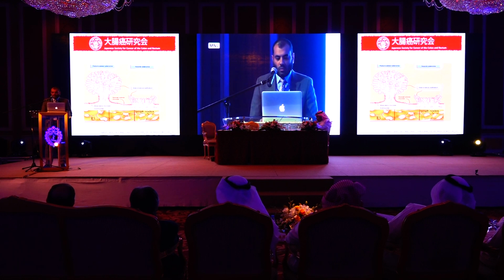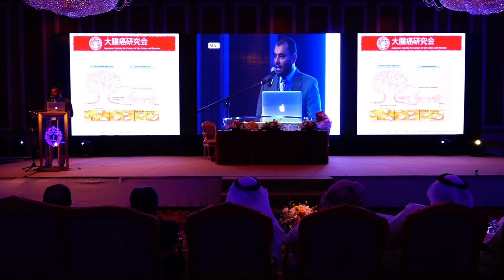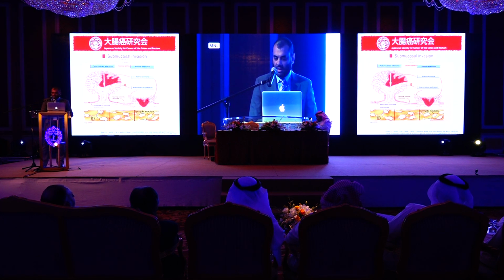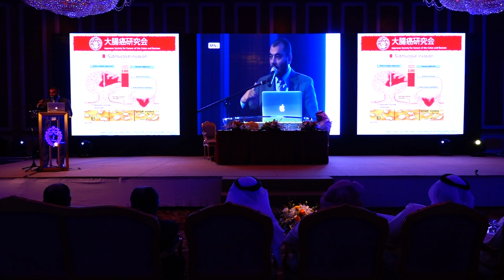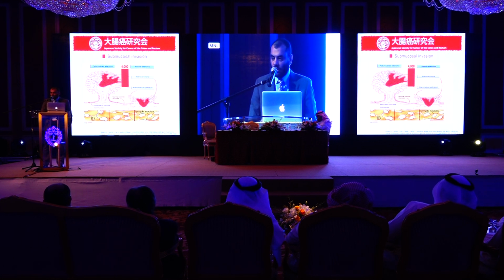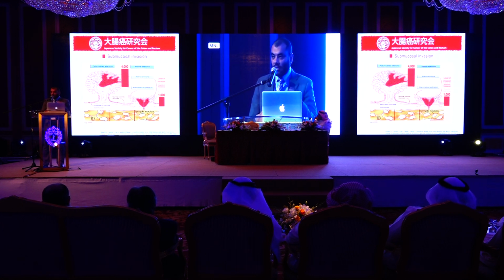We'll explain more. What is the meaning of that? This is just an adenomatous polyp here. It doesn't have any high-grade dysplasia or cancerous tissue. If there is cancerous tissue in the head of this pedunculated lesion, and the depth of invasion of this cancerous tissue is more than 3,000 microns, we will expect lymph node metastasis. If less than 3,000 microns, no lymph node metastasis. Here it is more than 3,000 microns, so I expect lymph node metastasis in these regional lymph nodes. And in a sessile lesion, if the depth of invasion is less than 1,000 microns, we will not expect lymph node metastasis, but if more than 1,000 microns, we will.